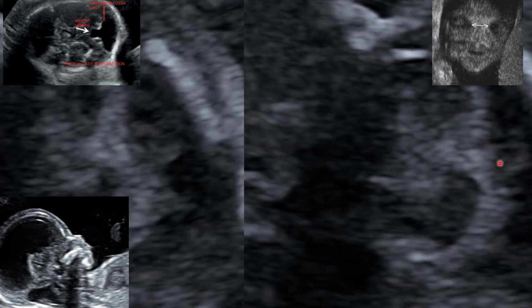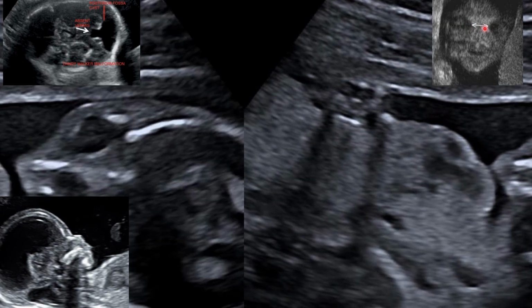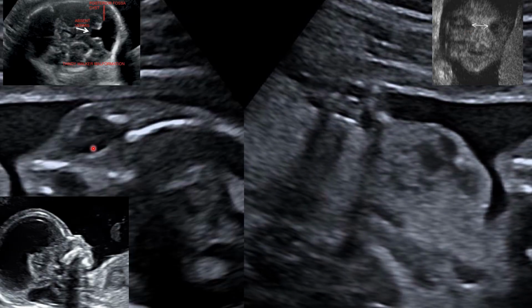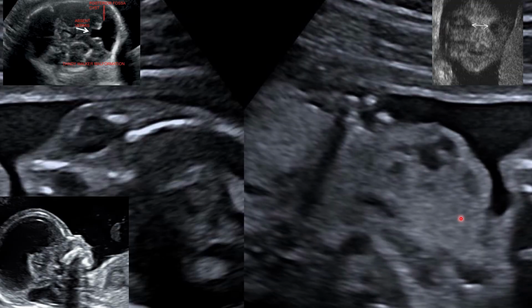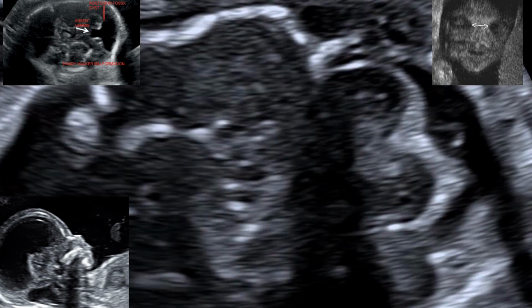So you also have to check the distance between the eyes. We call this the interorbital distance. The interorbital distance is very critical. Why is the interorbital distance critical?